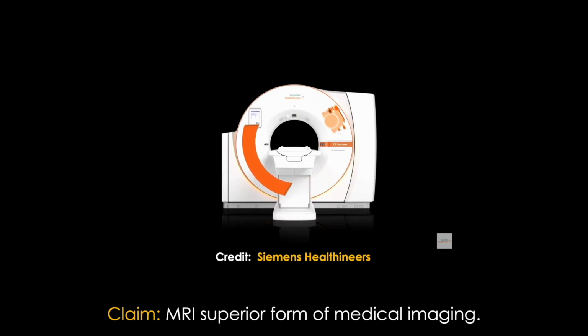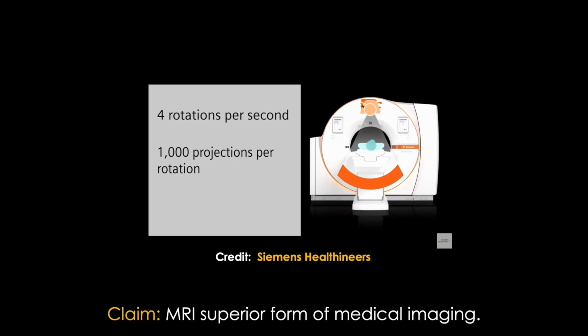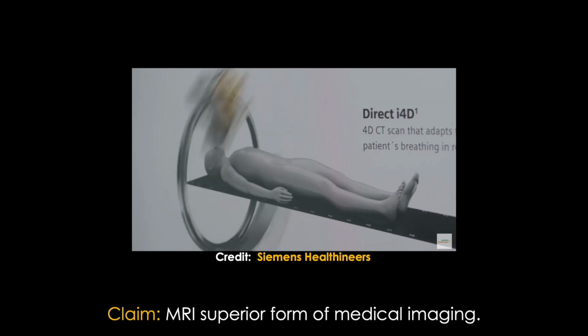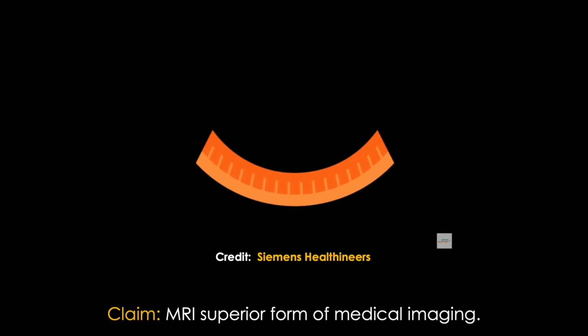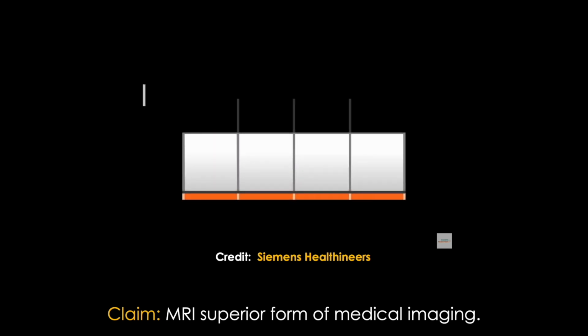CT scans were developed about a decade before MRIs were, and today can scan patients so fast they have to strap them down to the table to keep them from flying off. We can even create 3D models and even 4D images, folks. 4D. I wonder if it's like those 4D movies where they blow air and water in your face during the scan. Anyway, CT is far cheaper and faster than MRI. The downside being it does expose you to ionizing radiation, whereas MRI does not.